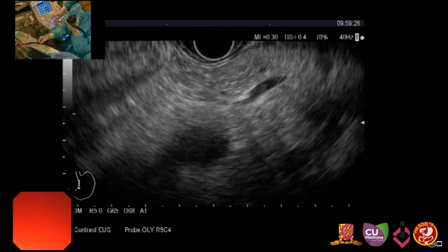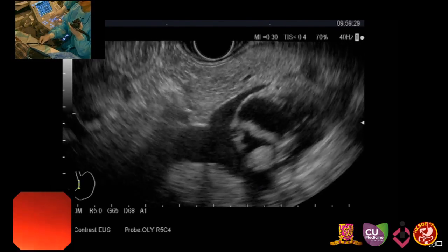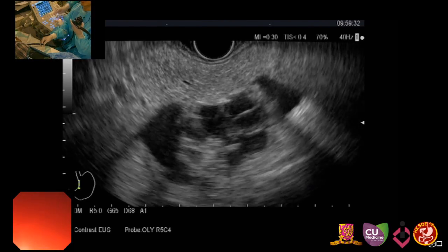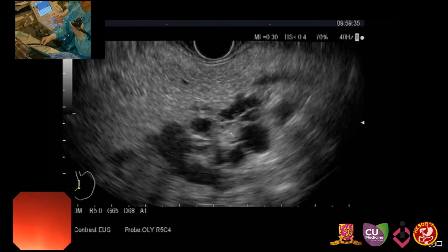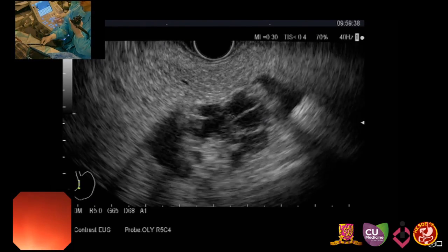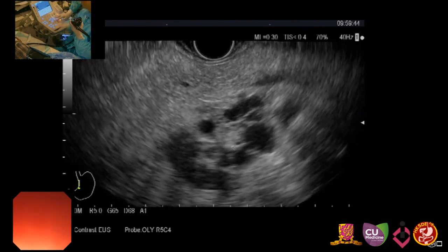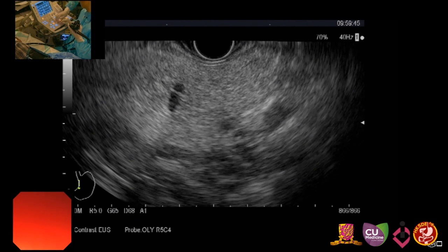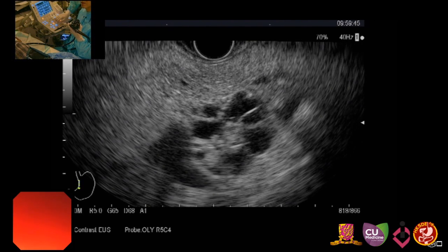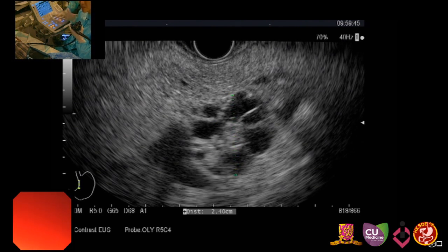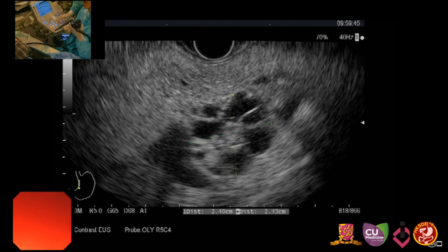If I rotate a little further, I can appreciate a cystic structure here — a fairly large cystic region. This is different from pseudocysts or simple cysts; it looks like a cystic tumor. We can see this is a septated cystic region, not a unilocular cyst. There are multiple septations inside, and the septa show prominent thickening.